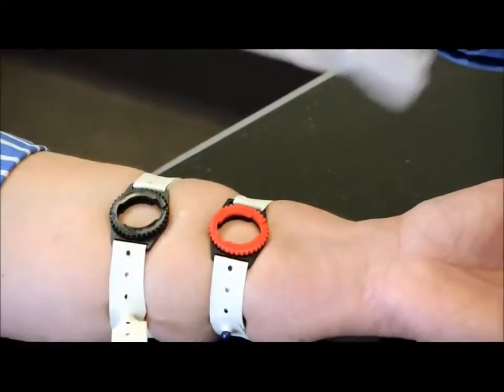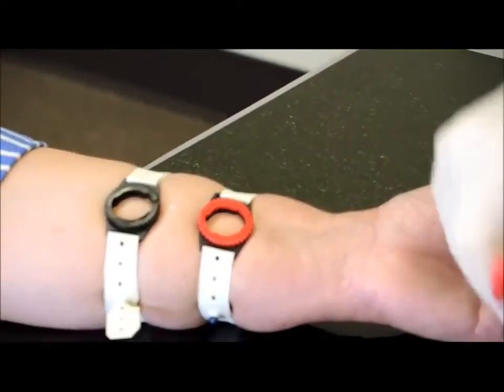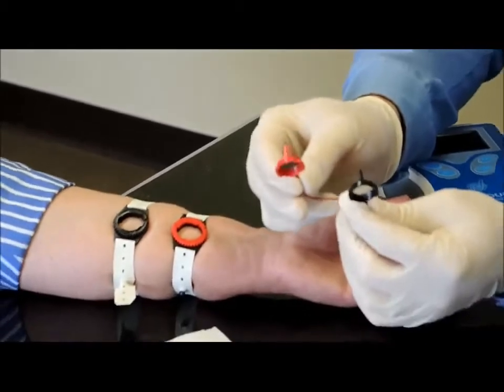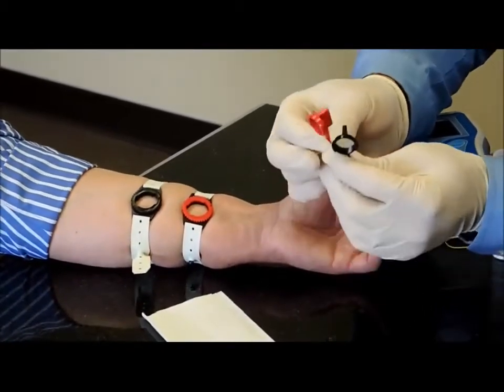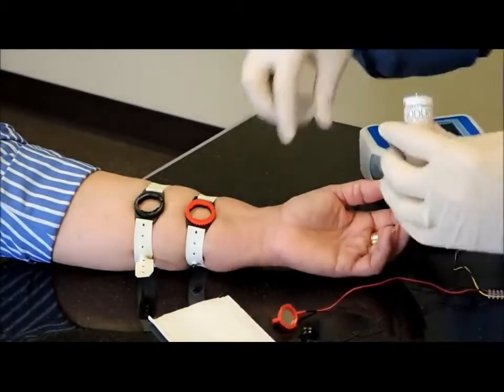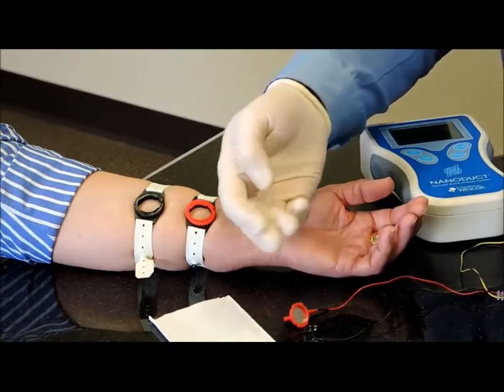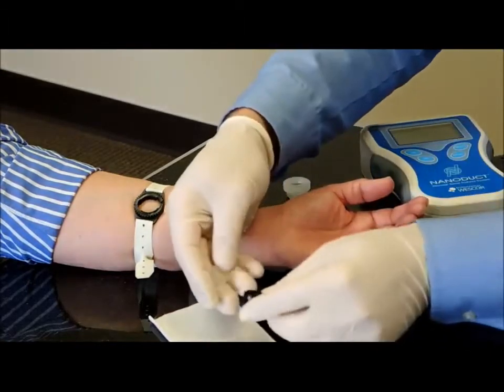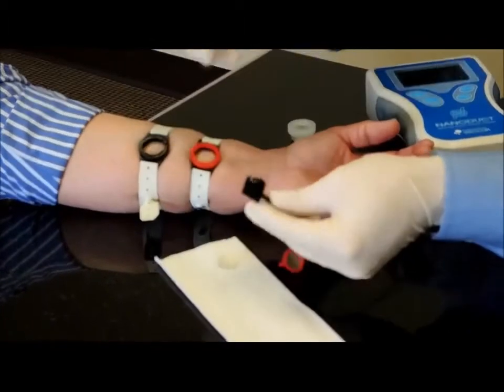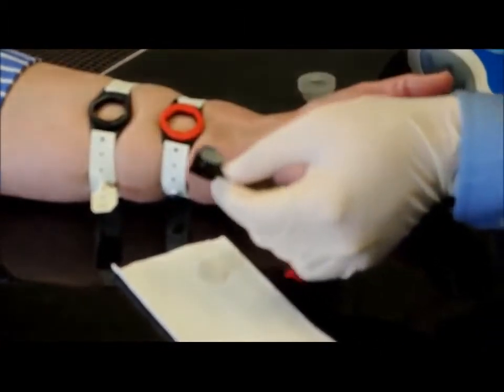So now that we have the straps in place, we're going to perform the iontophoresis. And so you notice on the electrodes there's a black and red electrode that are just a circle, and you'll put a disc in each one of those electrodes. So here's 2 discs. Put it on a paper towel. So I put it into the black electrode, make sure it fits down tightly.